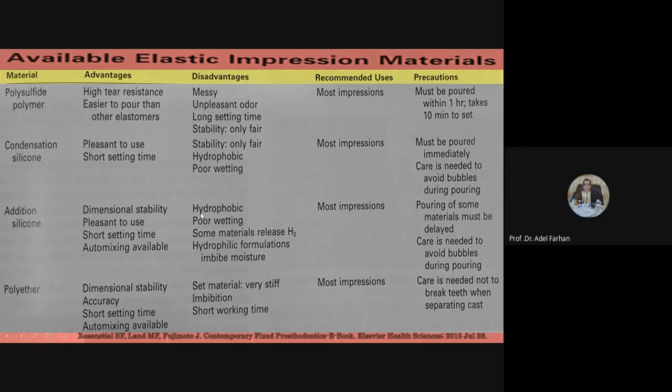most of the time الماتيريال اللي نستعملها هي الاديشن سيليكون امبريشن، ما بيها بايو برودكتس. اوكي، بايو برودكت ما بيها، لذلك ممكن تاخر السيتنج البورنج مالته لفتره طويله. هي هيدروفوبيك، لكن nowadays اكو نيو فيرجن باي كير طلعوا لنا يكون هيدروفيليك. اوكي، dimensional stability مالتها عاليه. طبعا تفاصيل هذه الماتيريال كلها موجوده بالبي دي اف راح ينزل لكم ان شاء الله. يعني بس هذا الجدول يوضح لكم الشغلات اللي لها علاقه بعملنا نحتاجها اللي تكون امامنا كل ما نختار ماتيريال او نستعمل ماتيريال معينه during impression.